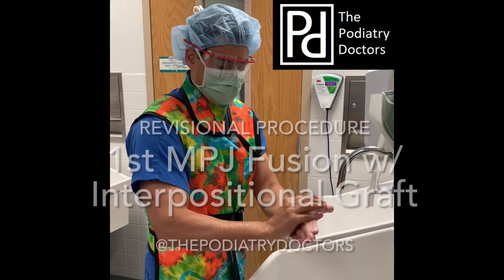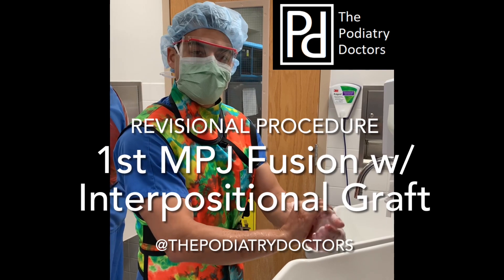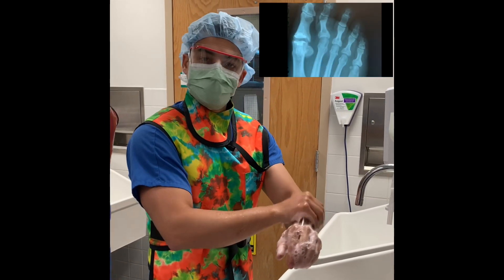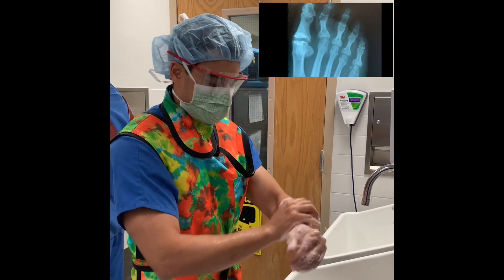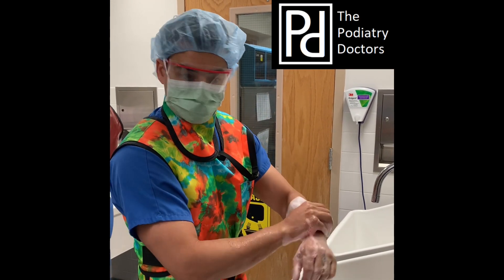So this is Dr. Oxios. What we're getting ready to perform is a revisional first MPJ surgery where we're removing old celastic implants and we're going to be putting in an interpositional bone graft prior to fusion.